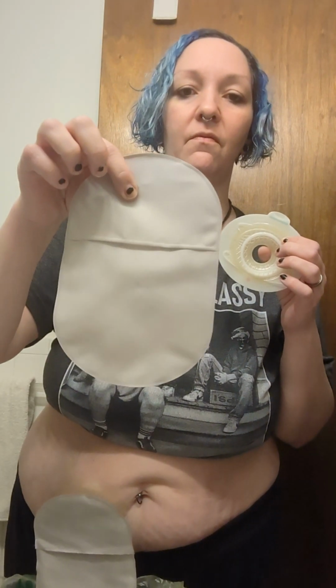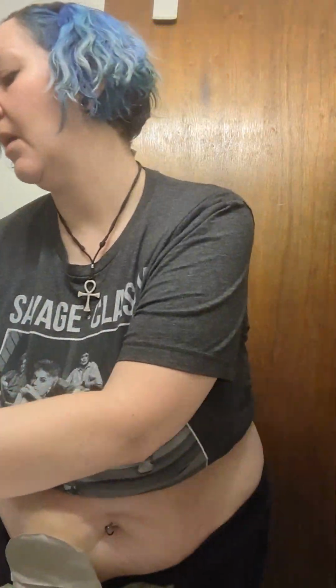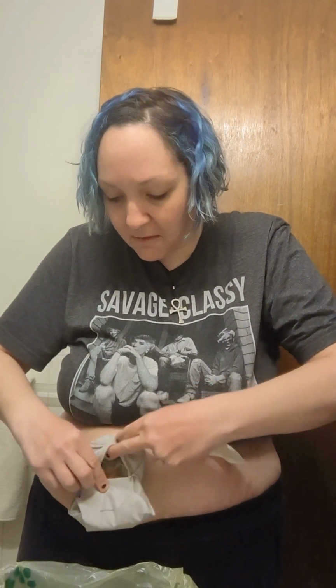My bag is fine. I mean, it's not leaking. There's not a major issue with it, but I had a leak last time, so I just need to be careful. I have all my products set up, including the garbage bag inside the waste bin, which is super important. That has not changed. I have a 2-piece bag now with an option of closed at the bottom or drainable. And the drainable, these are so awesome because, I'll show you, I'm wearing one. The drainable bags, these are Sensura Mio by Coloplast. You can go into a mini.